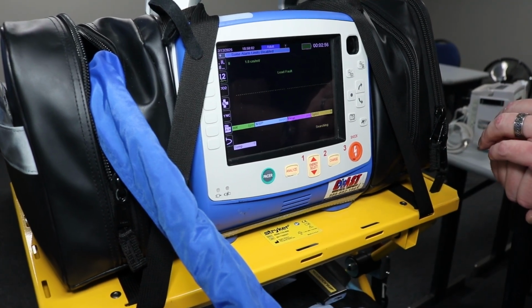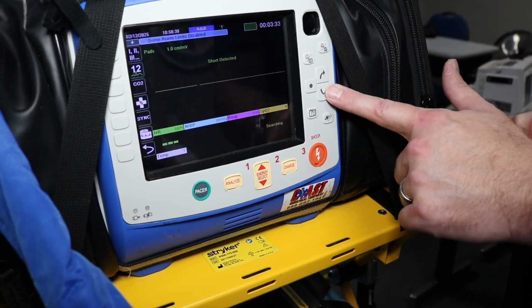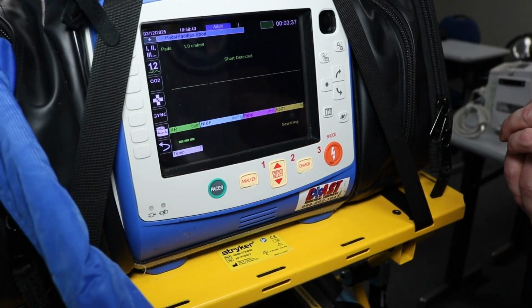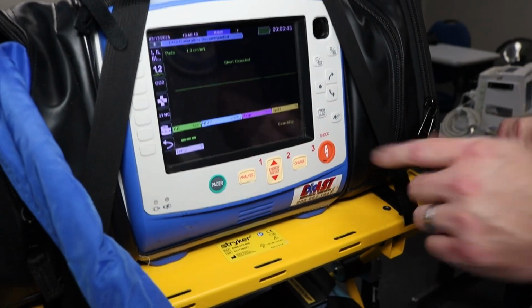Hit it again to stop your print. Anytime I want to get a stat blood pressure, there's a stat blood pressure button here. There are also some moving cursor buttons here and a select button. This is what we're going to go over right now: how to set up our Q15 minute blood pressures.